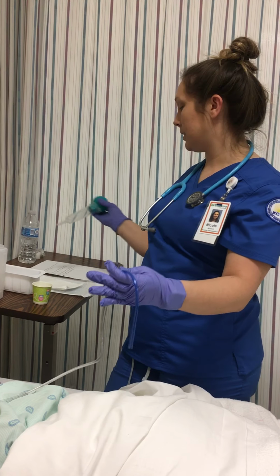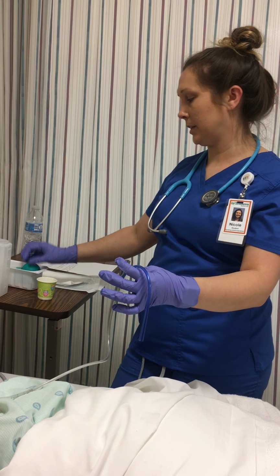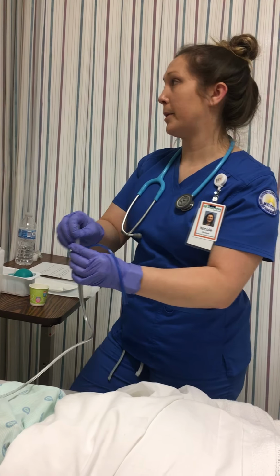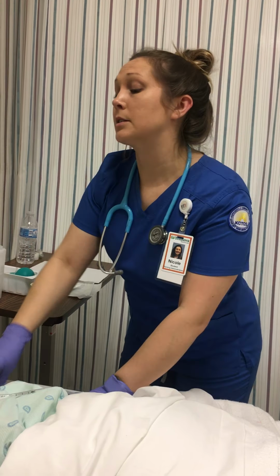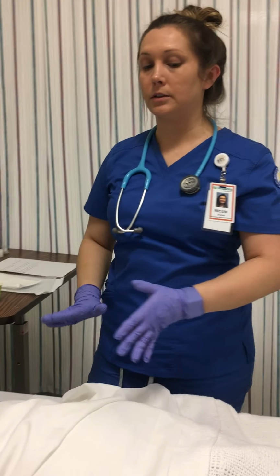Once it is, then we're done with that. So I'm going to connect this back to the suctioning per doctor's order. Assess the patient, make sure they're still doing well, document my findings.